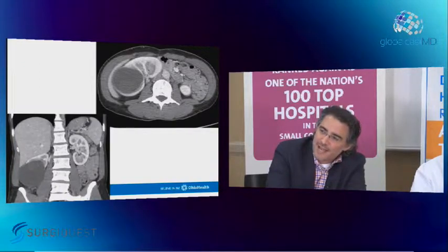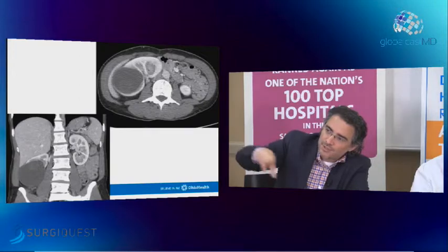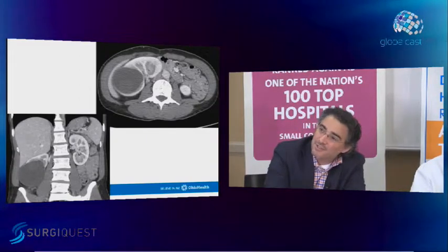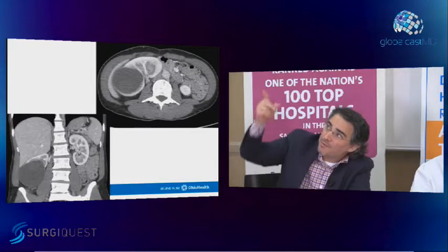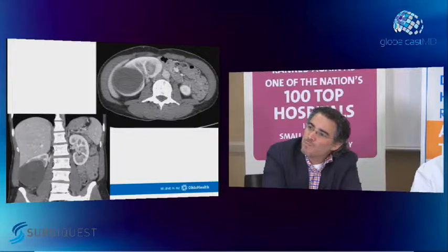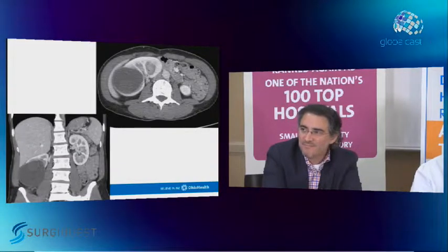The other question, which I would ask myself, but I probably wouldn't have the guts to do it, is does that outer cyst truly look like a simple cyst, and is the center thing really just the concerning lesion? But I would probably do a partial nephrectomy. And I'm always nervous when I do partial nephrectomies for cystic masses. I'm always worried about popping the cyst.